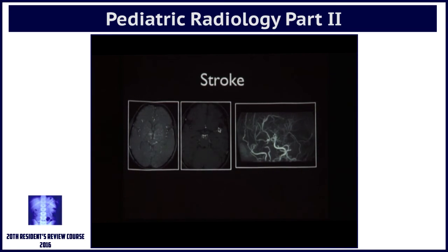So that will eliminate the need for all the small collaterals, and you will have the external carotid artery, then the superficial temporal artery going and supplying the MCA retrograde, and then that will prevent the stroke-like episodes. So the need for doing an MR angio is to look which MCA he should target. Right MCA is fine, so let's do a right MCA STA bypass. Left MCA is looking better caliber, let's do a left MCA STA bypass.